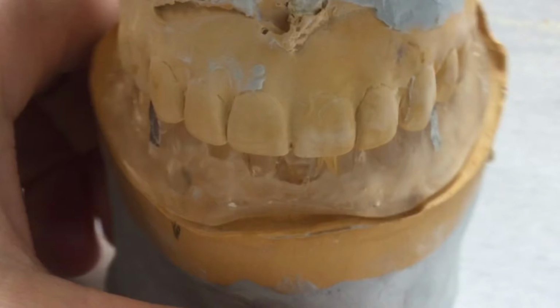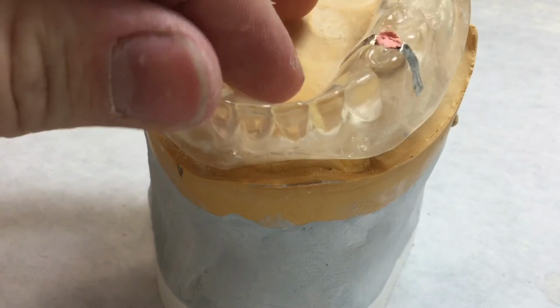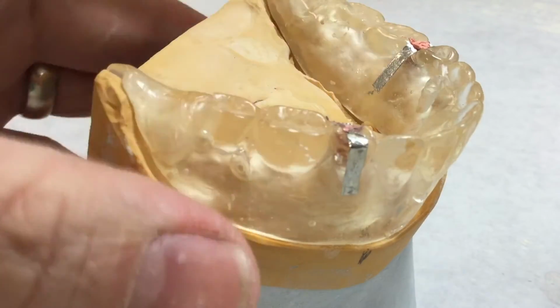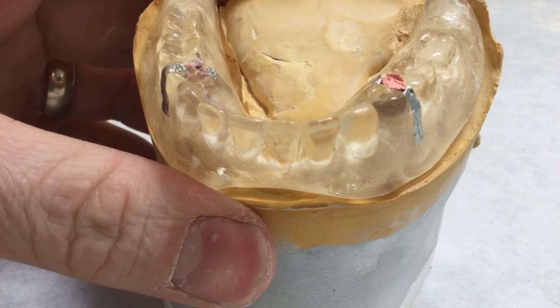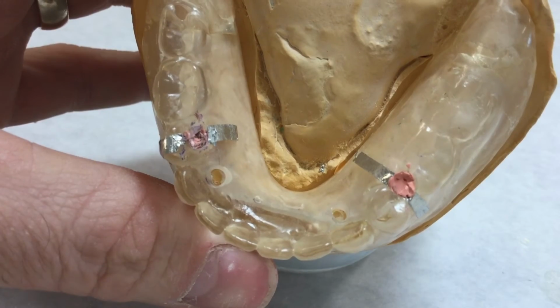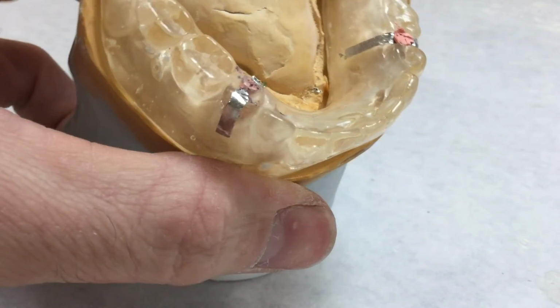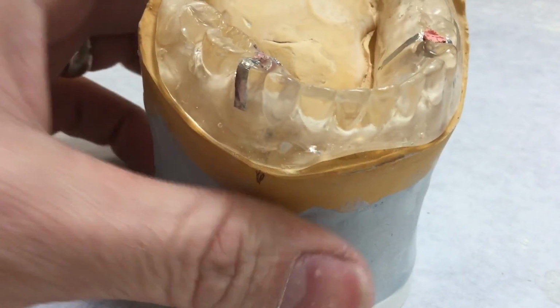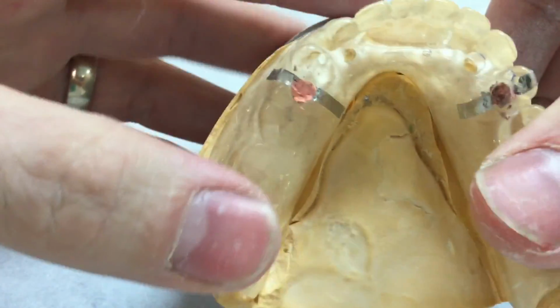In order to attain 15 mm of clearance, vertical bone height reduction may need to be performed at the time of implant placement. The radiographic stent should be modified by adding access holes to the occlusal or cingulum surfaces of desired teeth, or the acrylic lingual to anterior teeth over the residual ridge. Access holes represent the restorative ideal positioning for implant path of placement. The guide is now ready for intraoral use during cone beam radiologic image acquisition.